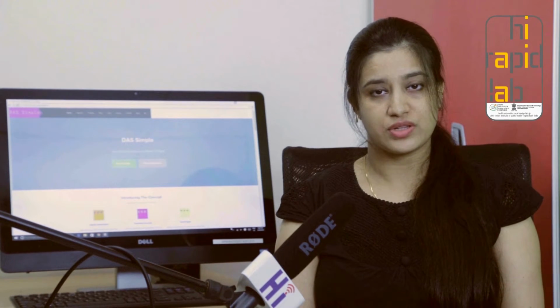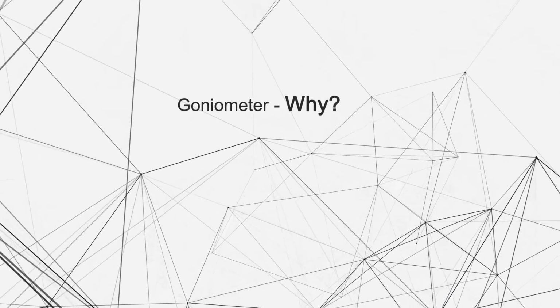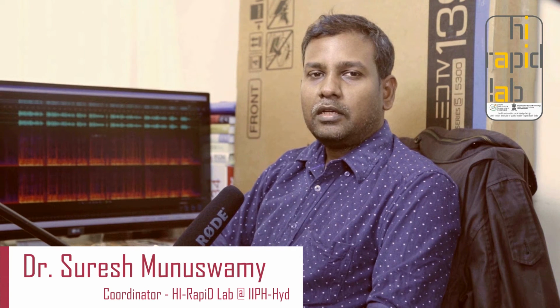Let's move on to the question number 2. Why does one need a goniometer? A goniometer is used to measure joint angles or physical range of motion in degrees. The process of assessment is known as goniometry. A little bit more of history at this point. The term goniometry is derived from 2 Greek words, gonia meaning angle and metron meaning measure.